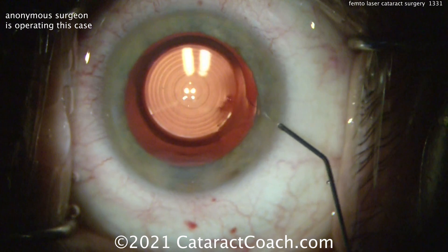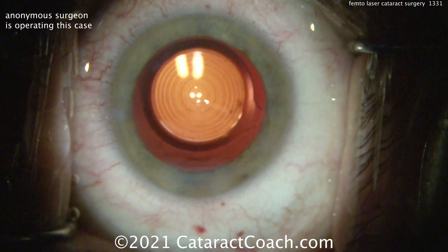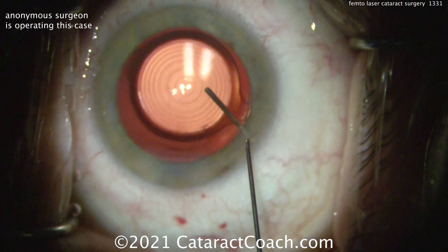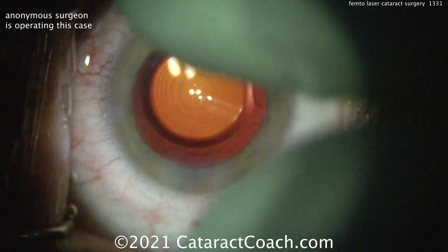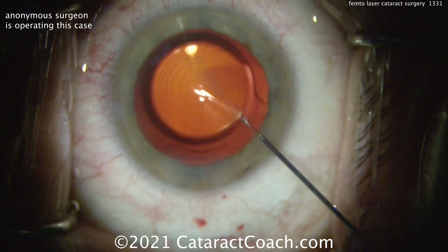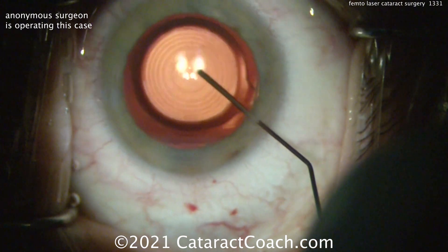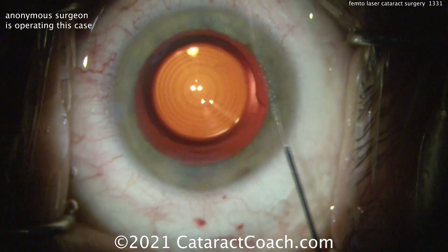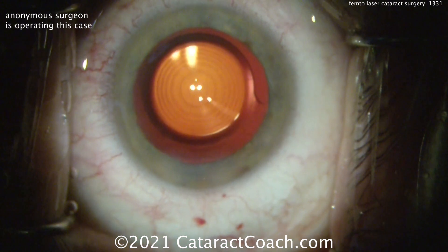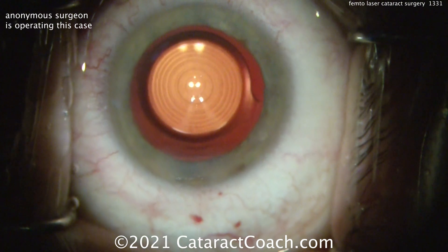Maybe it's useful for an intumescent white cataract — that can be useful if you can create the capsulotomy even when the pressurized capsular bag is really tense or there's loose zonular support. That can be helpful. We've even had surgeons use it for other novel techniques like for IOL exchange. If you have a phimotic anterior capsule, you can use that femtosecond laser when you're doing an IOL exchange — as Dr. Nicole Fram and Dr. Sam Masket have shown us. You can use that laser to open up that capsule and then get the lens out and you have a new capsulotomy. It may damage the IOL, but you're going to throw it away anyhow.